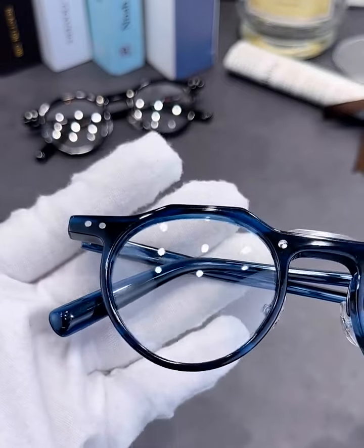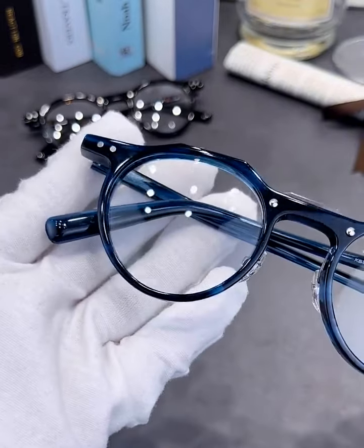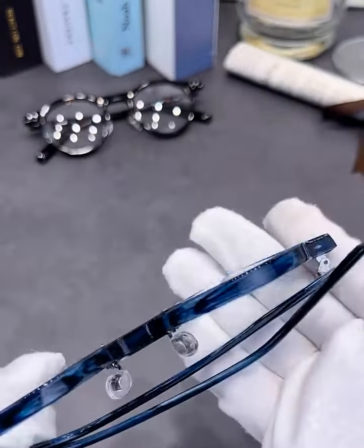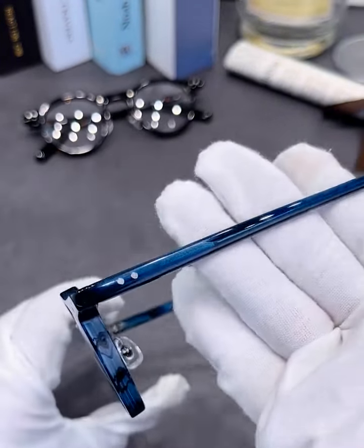Classic crown shape with rounded edges. The semicircular design of the lower edge balances the sharpness of the upper edge. Unique design at the bridge of the nose, with a rivet design at the tip and temples.